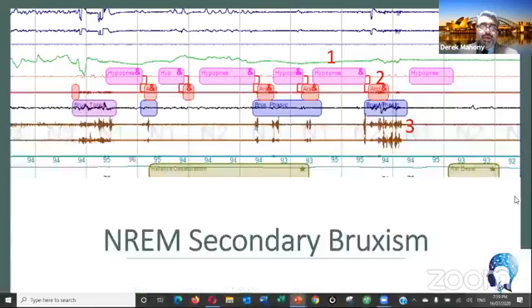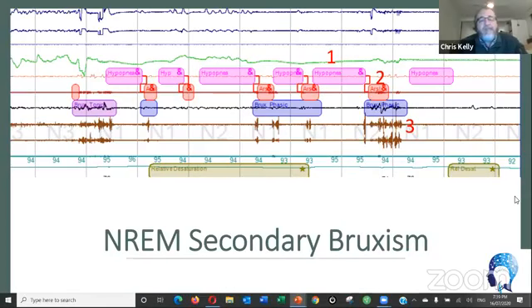Chris, I'll let you talk on that one. Well, this is a part of a sleep study. You can see the light grey bit in the bottom that says N3, N1, N2. They're different stages of sleep. N3 is deep sleep, and that would have been proceeding off to the left of that snippet. Off to the right, we've got some light sleep. Then we try to get into a deeper middle sleep, and then it goes back up into a light sleep. And curiously, there's a bruxism event.